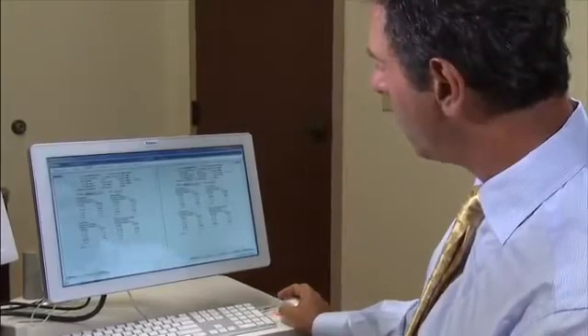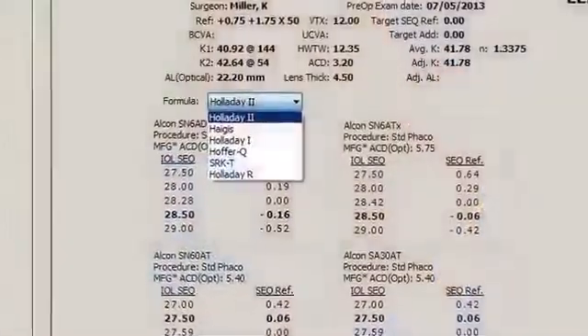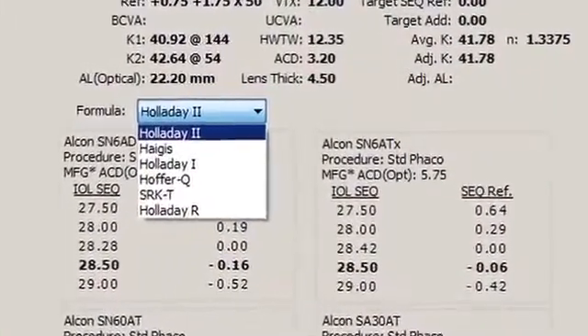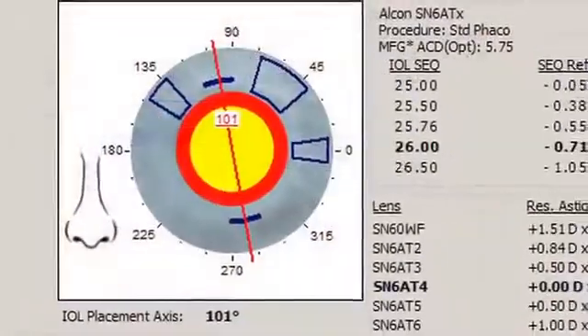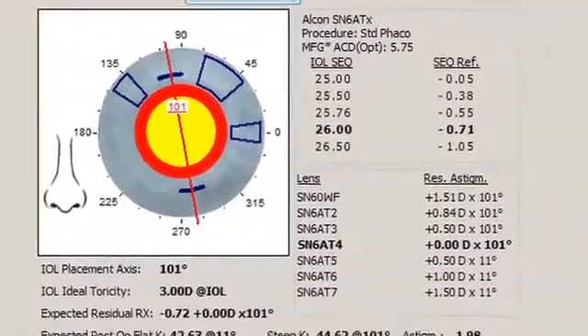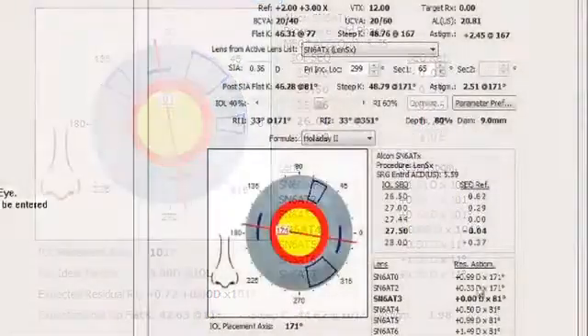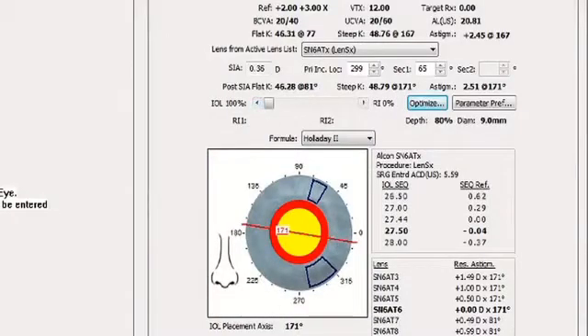The Verion Reference Unit allows surgeons to efficiently select the IOL and lens power for their patients by providing multiple established formulas in a simple drop-down format. Most importantly, the Verion Reference Unit also provides comprehensive astigmatism management. Surgeons can now determine optimum incision locations to individualize surgically induced astigmatism and toric lens powers at the same time.